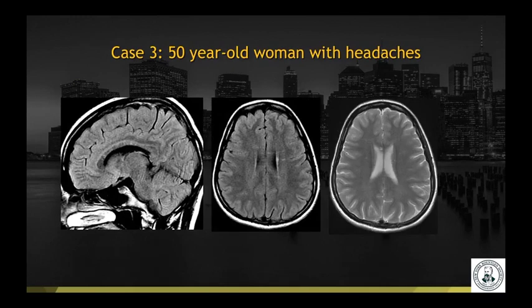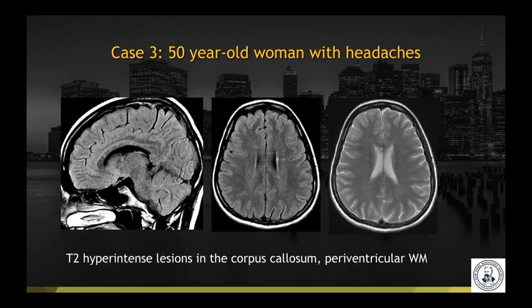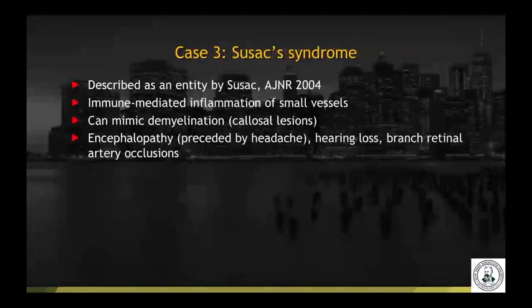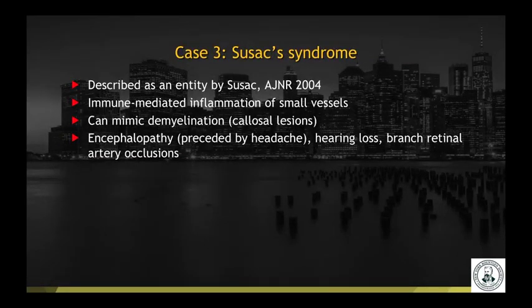Case number three: a 50-year-old woman with headaches. T2 FLAIR and T2-weighted imaging demonstrates T2 hyperintense lesions in the corpus callosum as well as the periventricular white matter. This is a case of Susac syndrome. It's an immune-mediated inflammation of small vessels, but because of the imaging appearance it can mimic demyelination because of the callosal lesions. There is a classical clinical triad of encephalopathy, hearing loss, and branch retinal artery occlusions.